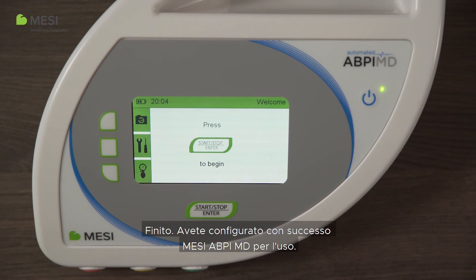That's it. You have successfully set up the MESI ABPI-MD for use.